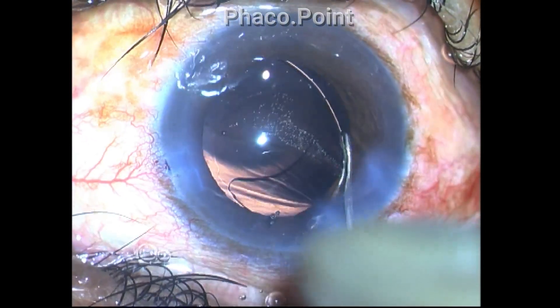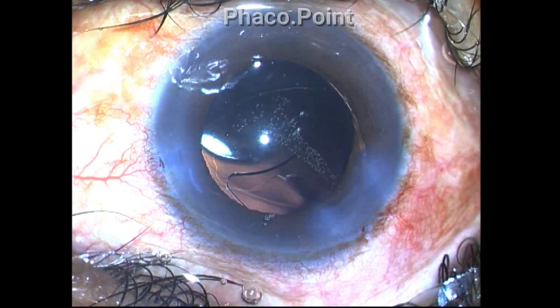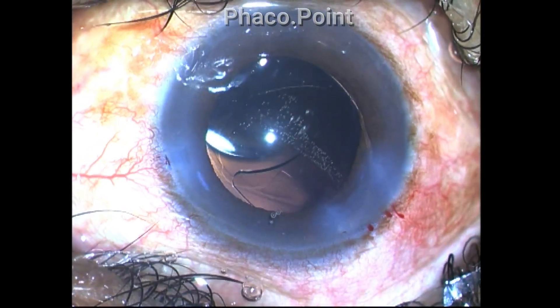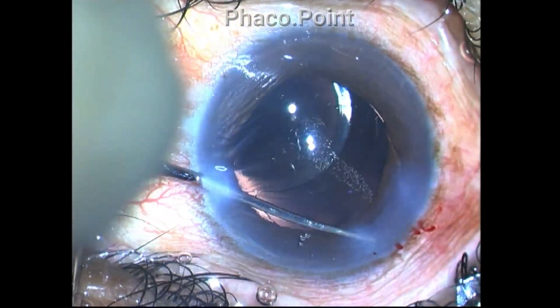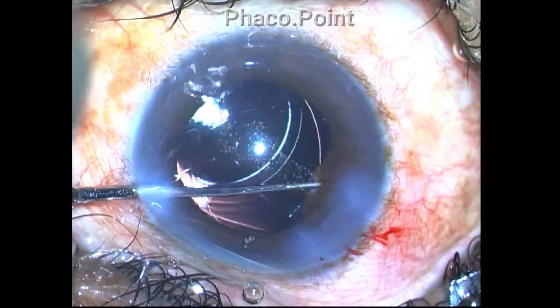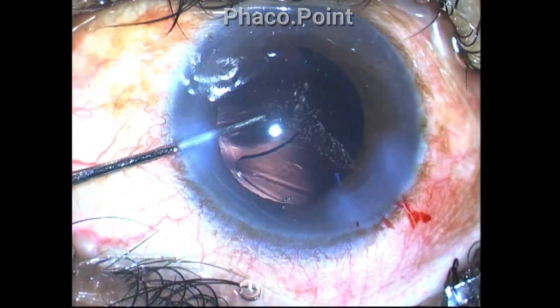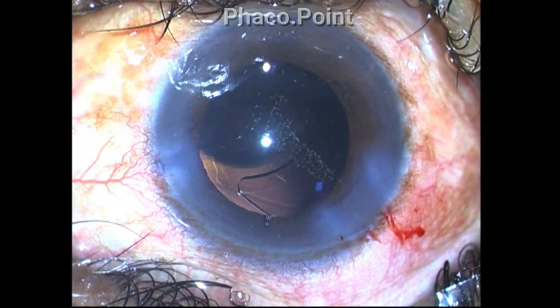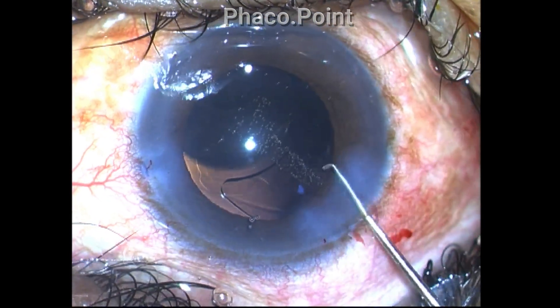Because the trailing eyelet was visible to me, I tried to re-engage it with the Sinski hook from underneath the sub-incisional area. The ring kept slipping, but with a little amount of effort I was able to get the ring finally into the capsular bag. However, even after performing this maneuver of getting the capsule tension ring within the bag, the lens did not center itself.